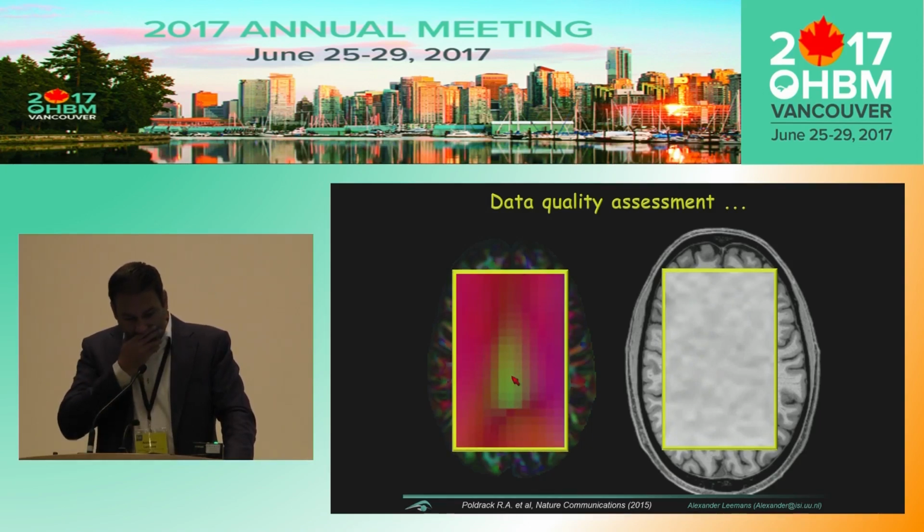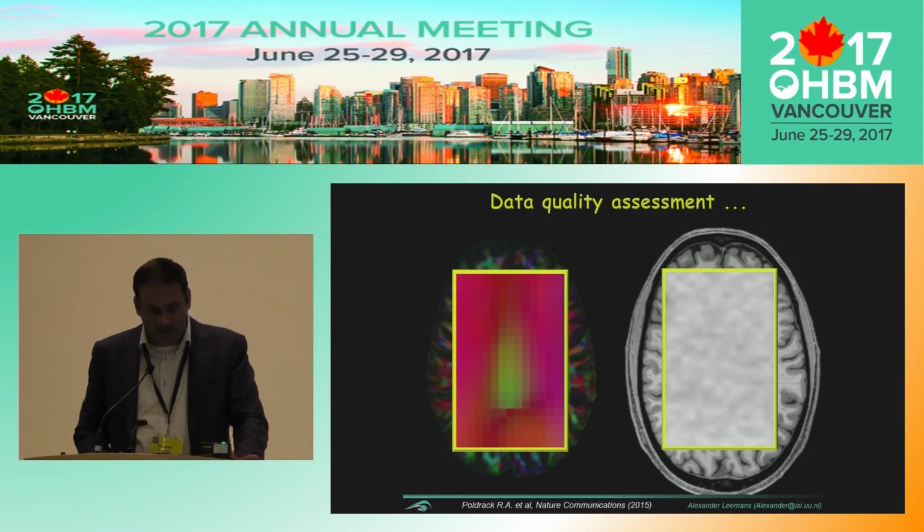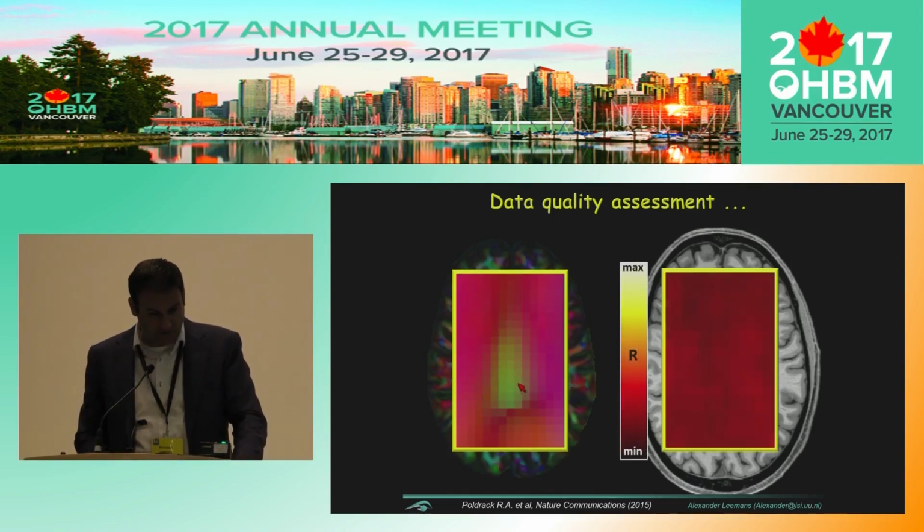So I was like, okay, Russ, are you aware that you've got a special brain? I mean, we all know he's very smart, so he must have a special brain. But in this case, it was like, what's going on here? Is this an artifact? And this is where residuals come to the rescue. If you look at the residual map, it looks fairly homogeneous. And I was like, okay, this is genuine. So there's a genuine microstructural abnormality in Russ's brain.